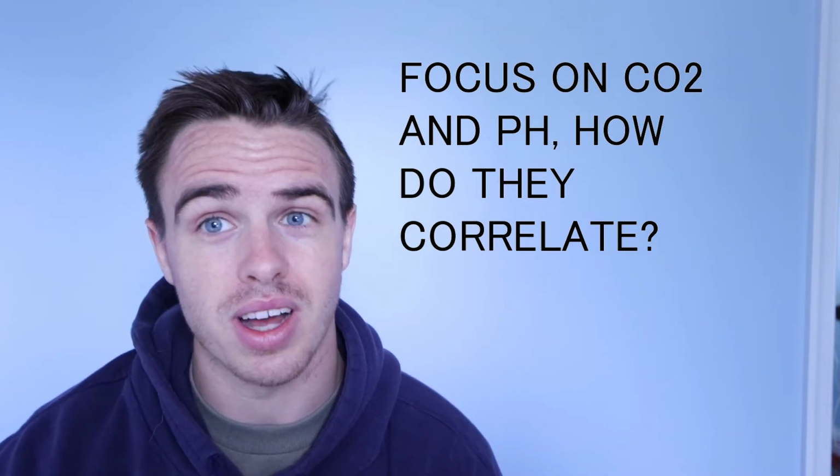Low CO2, high pH. I'm not going to go over all the reasons as to why a person may have high CO2. I'm going to save that for a different video. For this video only, I only want you to be able to interpret ABGs. So I don't want to confuse you too much, but now I want to jump into bicarb and pH. So let's just focus on bicarb and pH. Make sure you run through a lot of scenarios with just CO2 and pH, and then do the same exact thing for bicarb and pH.